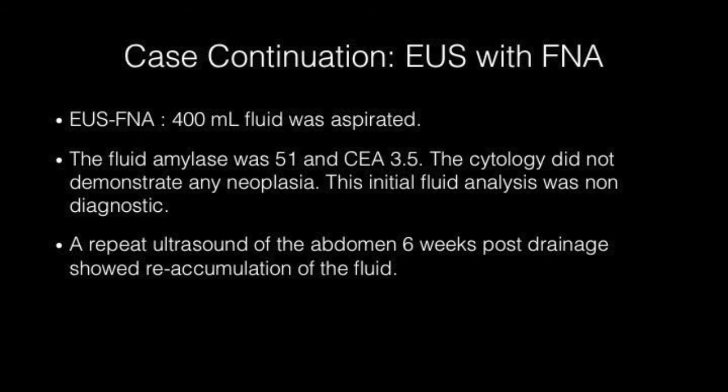The initial EUS-FNA in 2016 drained 400 milliliters of fluid. The fluid amylase was 51 and the CEA 3.5. The cytology did not demonstrate any neoplasia.